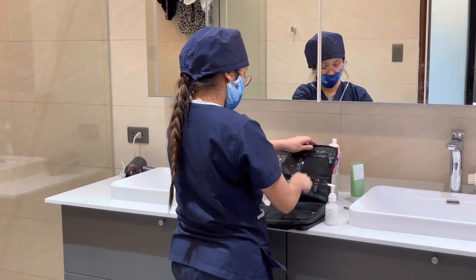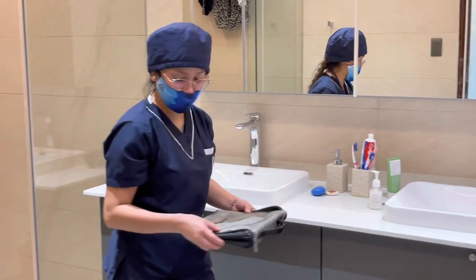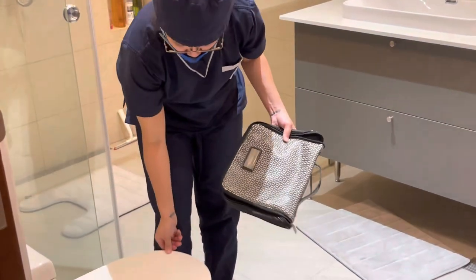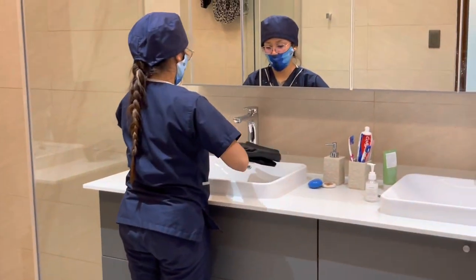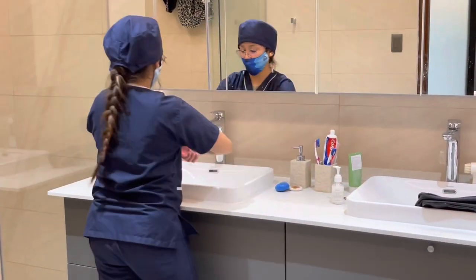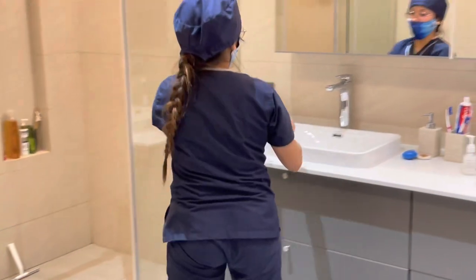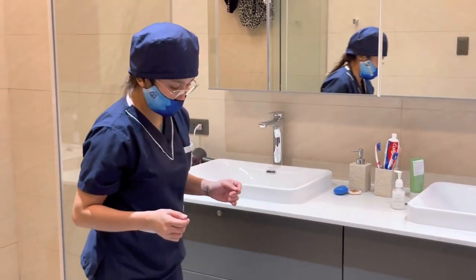Measure the remaining urine for intake and output monitoring. Discard remaining urine in the toilet bowl. Clean and dry the bedpan or urinal and put it in a designated place. Remove gloves and wash your hands. Send the specimen to the laboratory with the laboratory request form completely filled up with information. Document that the urine specimen has been collected.